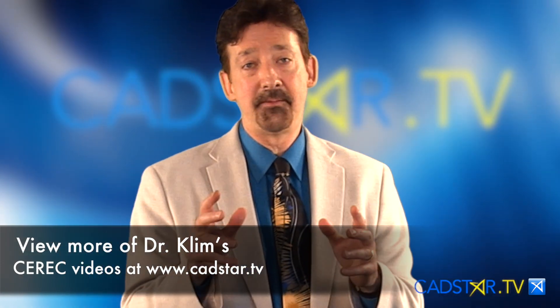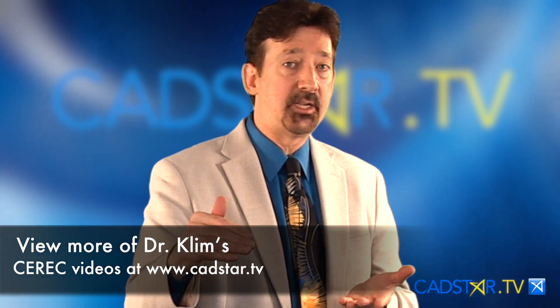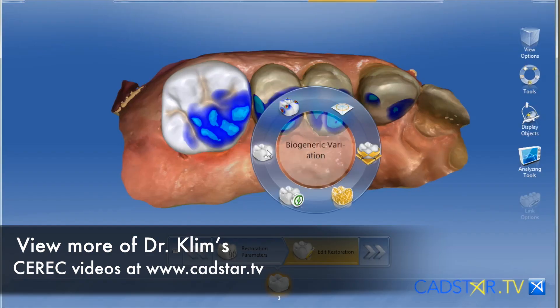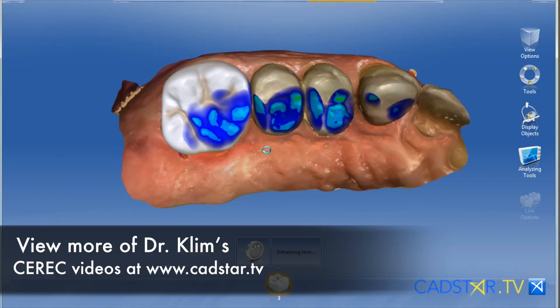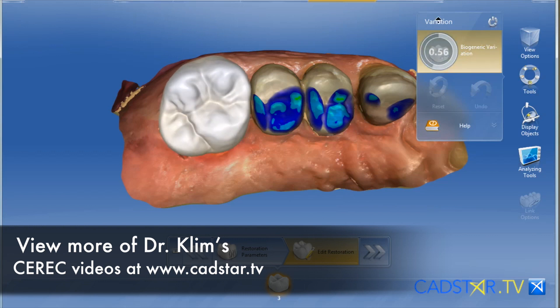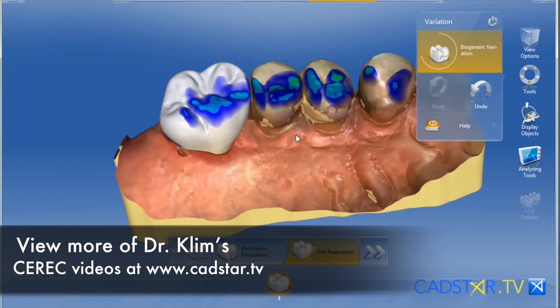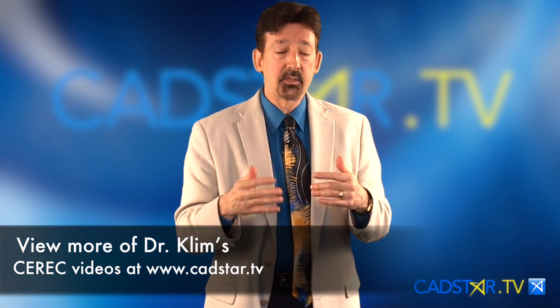Here's the caveat: when you're using biogeneric variation, make sure you use it as the very first action in your design sequence, because it will re-propose your tooth. If you've done other features on your restoration, you will lose those, which means you've got to start over again.